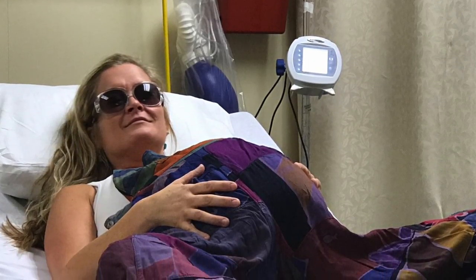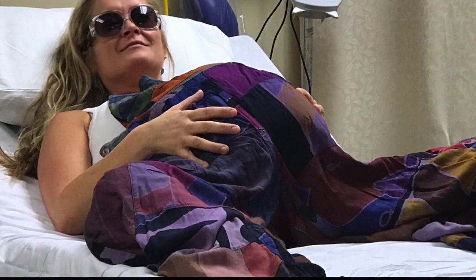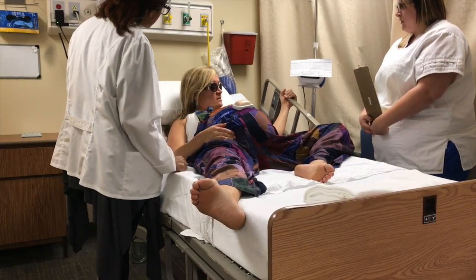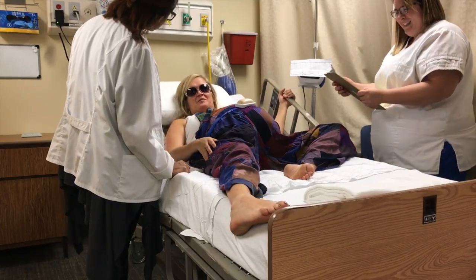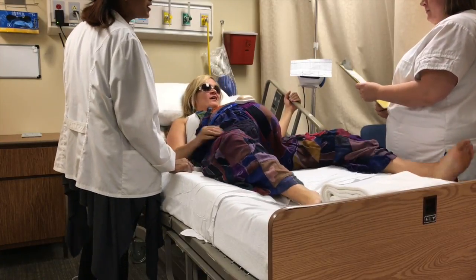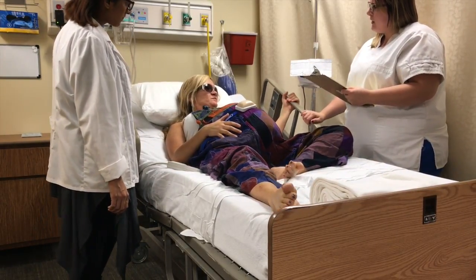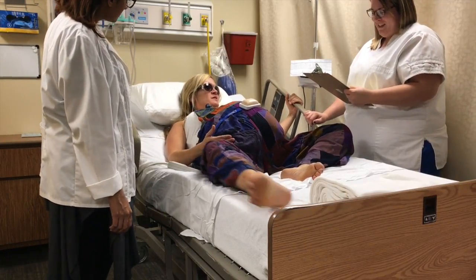This is a 32-year-old female. She's 34 weeks pregnant with a history of drug and alcohol abuse. Hi, Mrs. A. Oh, hello. All right, it looks like your baby here is having a slight decrease in heart rate. What? From its baseline. So how are you feeling? Baseline, it's his normal stats, so it just seems like it's quite a big jump. So we're going to try and figure out why. Nurse Carrie, do you know why? Are you on any new drugs or medications? No. Have you had any surgeries lately? No, not since I had this bad boy in me.